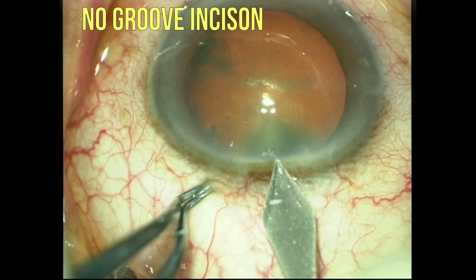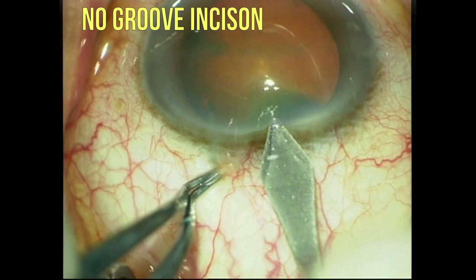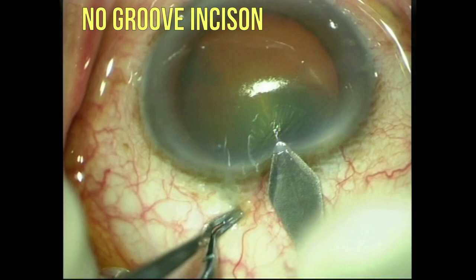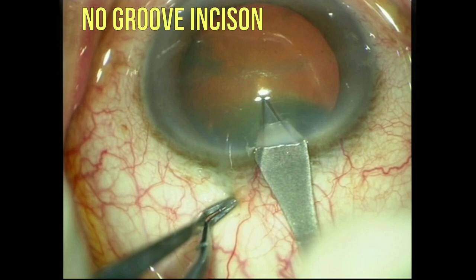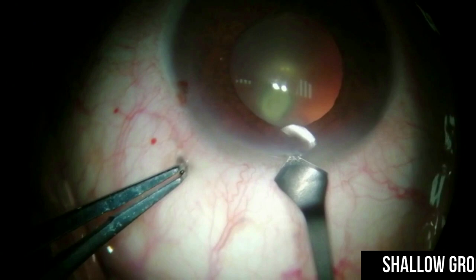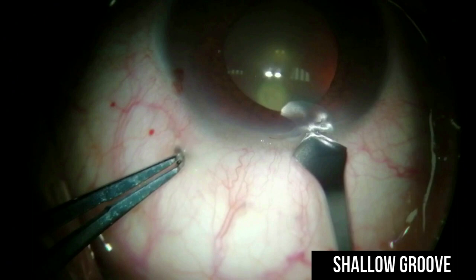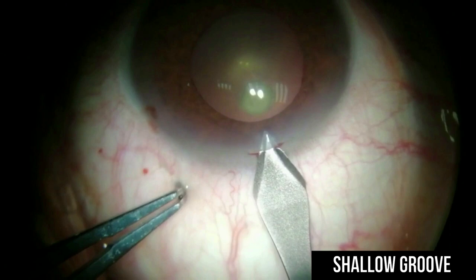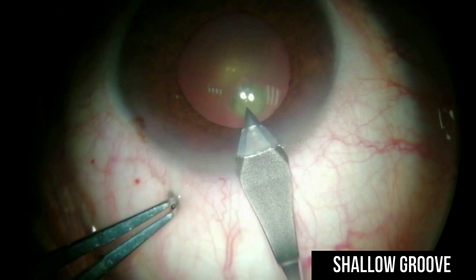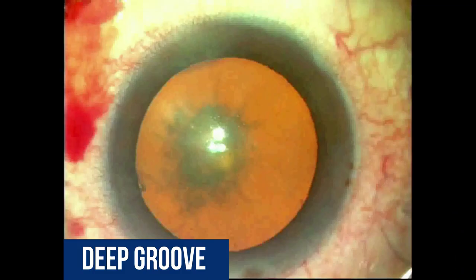The keratome tip enters the cornea when the heel of the keratome is slightly elevated. Then the keratome is tangentially passed for about two millimeters parallel to the cornea, then the heel is elevated again to enter the anterior chamber — this is a three-step pathway. In the two-step, bi-planar, or shallow groove incision, a shallow vertical groove of about 0.3 mm is made into the cornea, then the keratome passes tangentially 1.5 to 2 mm before entry into the anterior chamber. The rationale is to create a thick outer lip that can resist tearing, hence better wound stability.